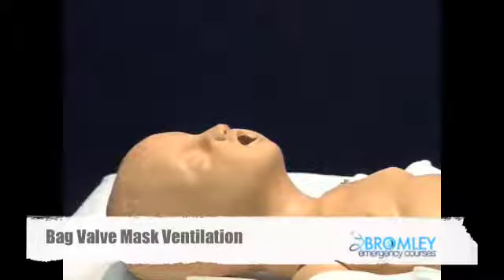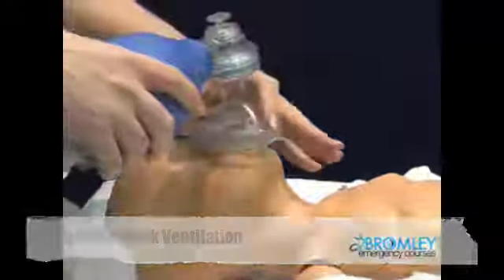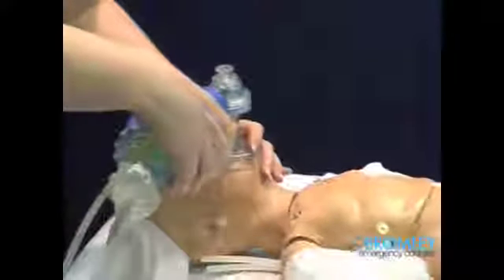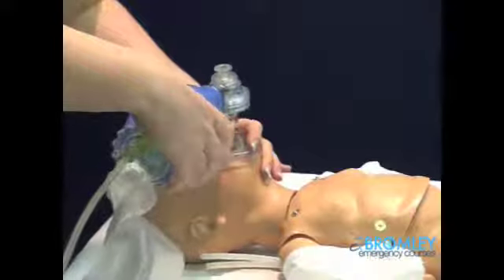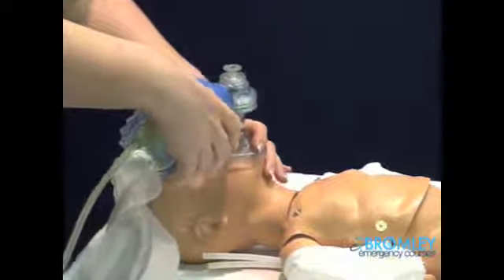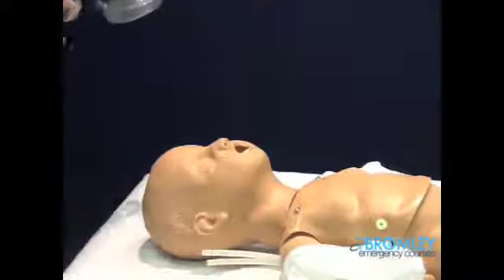If the infant were to stop breathing, you would need to ventilate the child using a bag valve mask. Paediatric LMAs are available, but in reality you are likely to proceed to intubating the child with an ET tube.